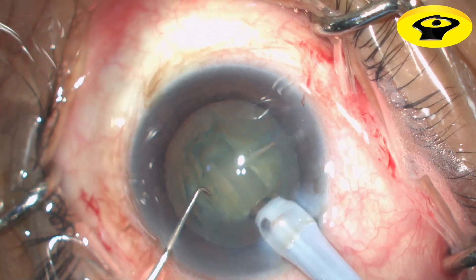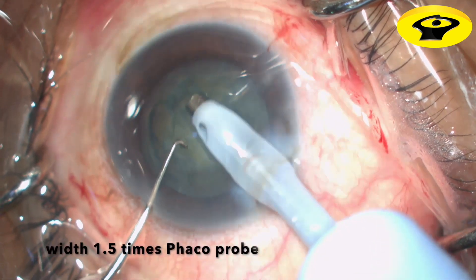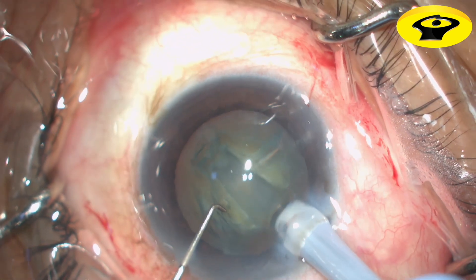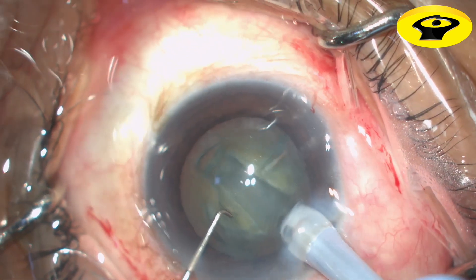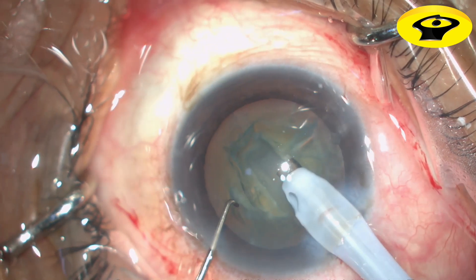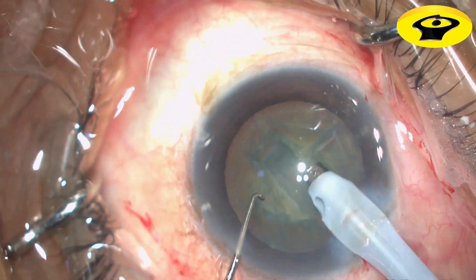The width of the trench should be 1.5 times the size of the phaco tube for the phaco tube to make the trench easily. Use phaco power only as you sculpt forward to reduce phaco time and energy released in the anterior chamber.